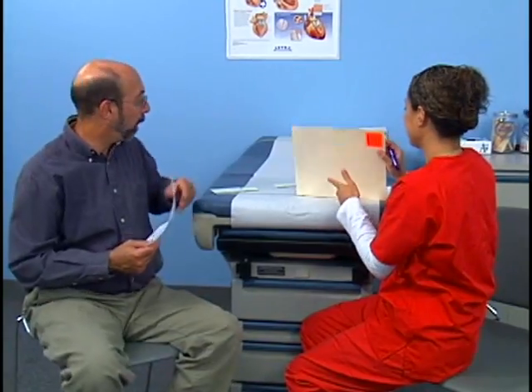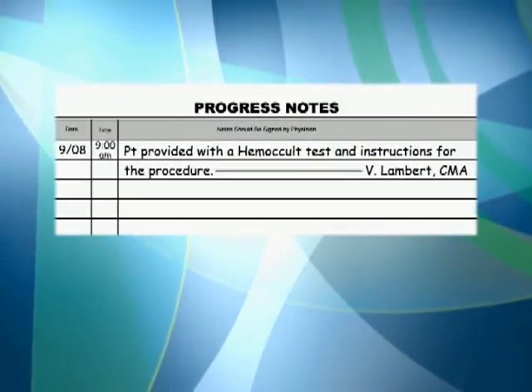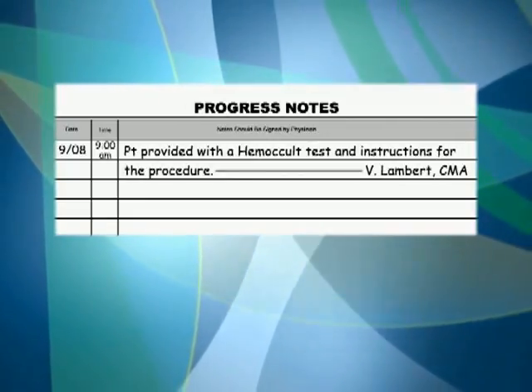Chart the procedure. Include the date and time, and document that the Hemoccult test and instructions were given to the patient.